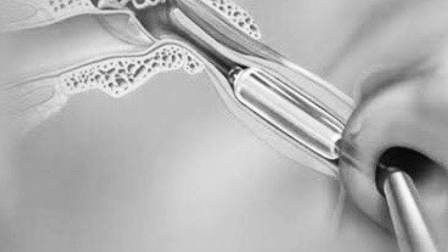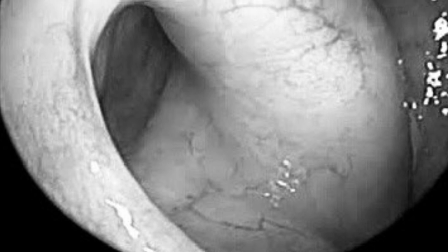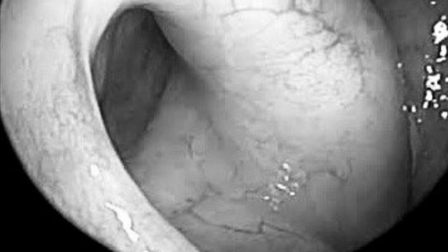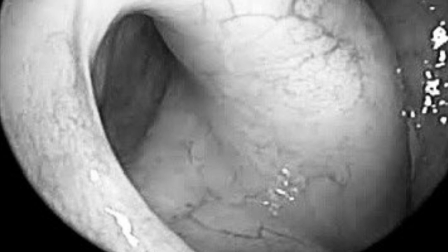While BDET is generally safe, potential complications include epistaxis, which is usually minor and self-limiting, temporary sore throat or ear pain from tissue manipulation, barotrauma which, though rare, can occur with overinflation, and persistent symptoms requiring repeat procedures or alternative treatments. For optimal recovery, patients should avoid nasal blowing or strenuous activities for 48 hours.